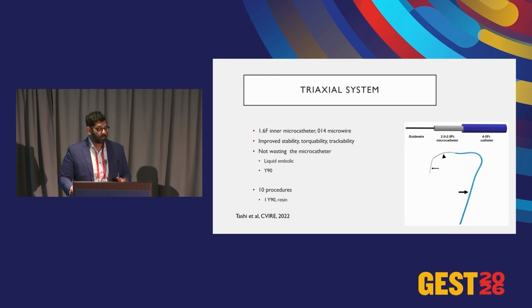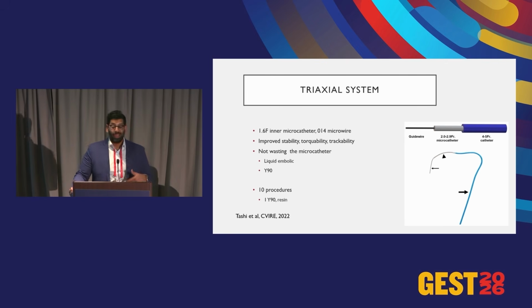In this study, of the 10 procedures they did, all were successful. Actually, one was a resin Y90 delivery. So nice to know that as well.